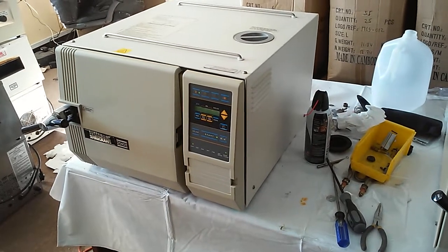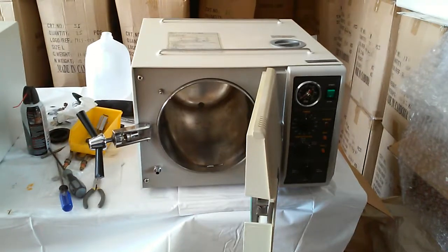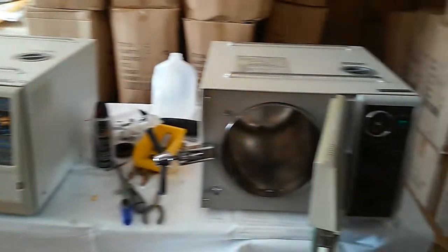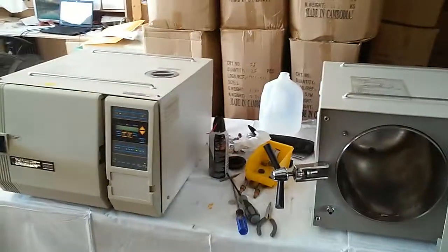There are also variants with the letters E, EA, EZ, and now they have EZ+. This is the 2540M and this one is the 2540E. The diameter is the same — the '25' means 25 centimeters, or what we usually call 10 inches.